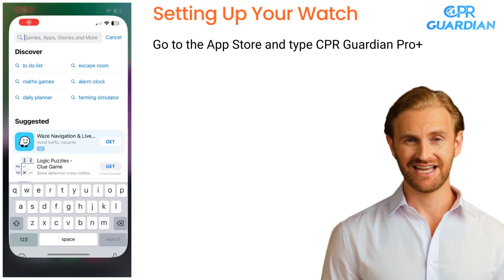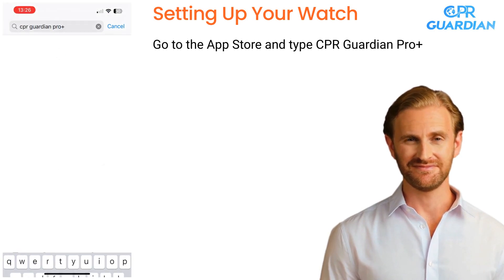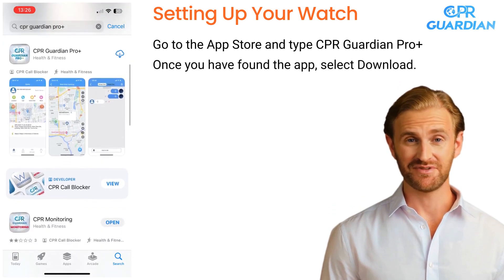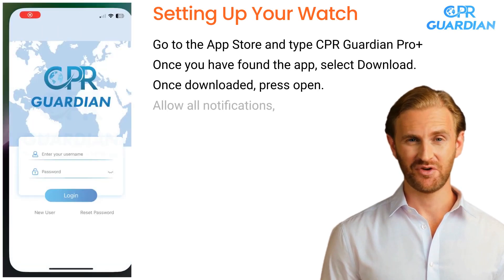Go to the App Store and type CPR Guardian Pro Plus. Once you have found the app, select Download. Once downloaded, press Open and allow all notifications.